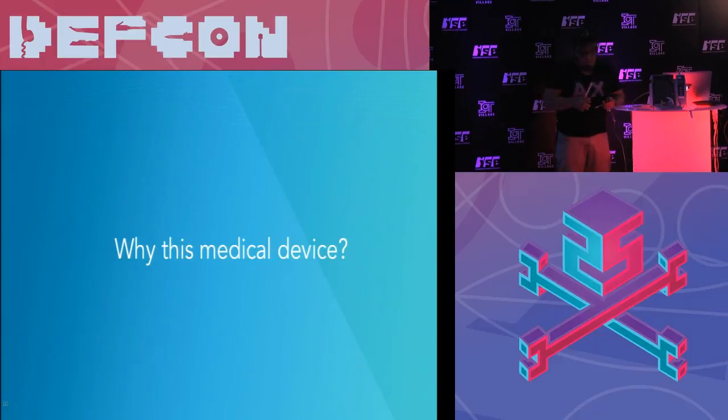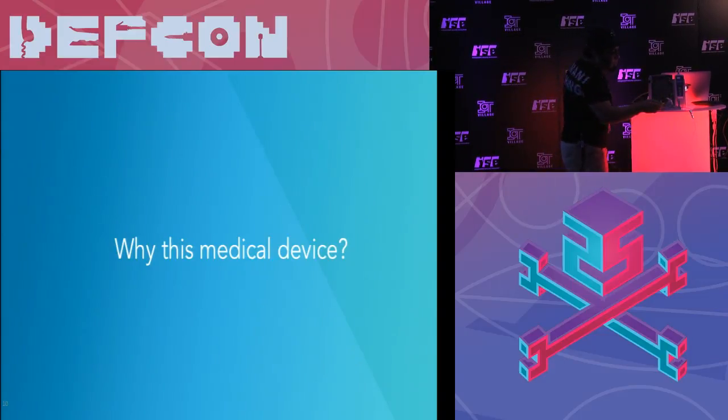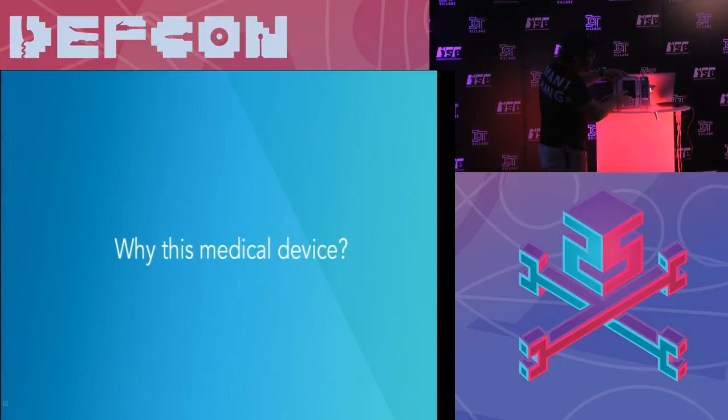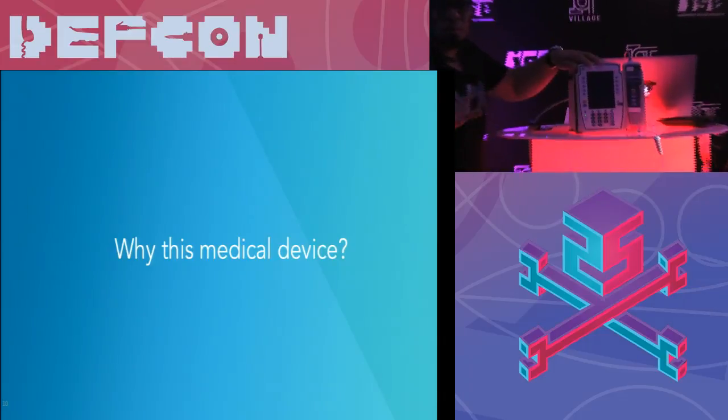So let me quickly show you. I'm going to be switching back and forth here. I'm just going to turn it on and show you how it works. These are the main components, and I'm going to describe all of them. This is the main unit. This is running the operating system, and we're going to talk about the operating system.